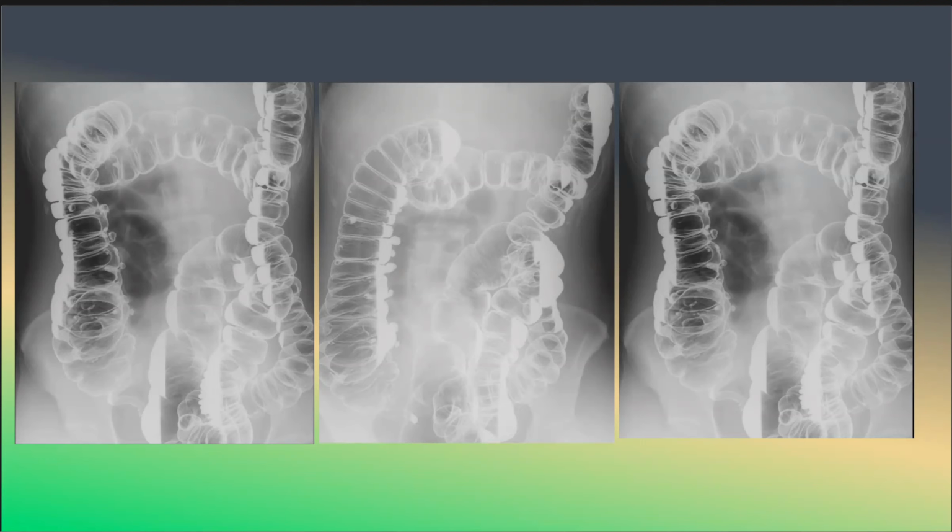And the diverticulosis, as we see, no treatment is required. And as we see here also, there are no signs of inflammatory changes involving the diverticuli. And this should not be confused with other causes like cholecystitis or inflamed appendicitis.